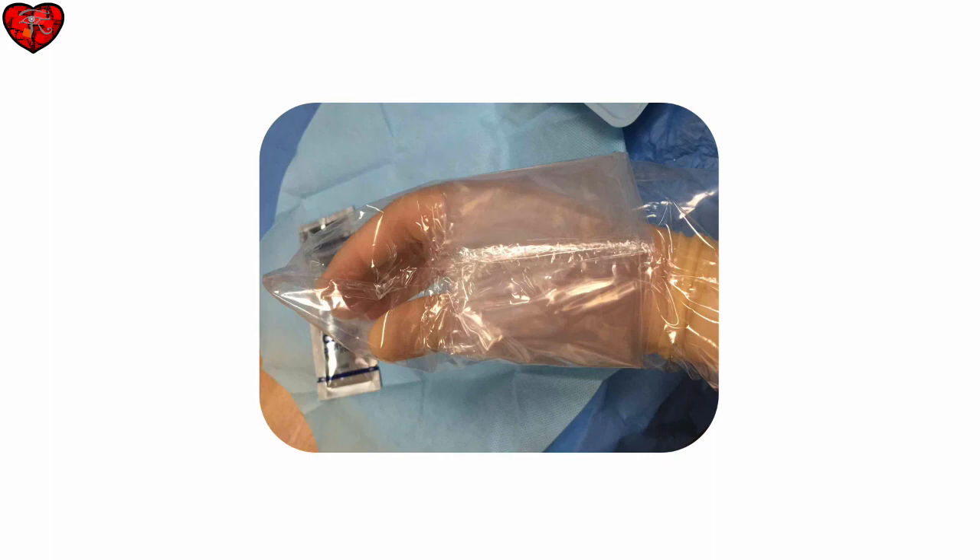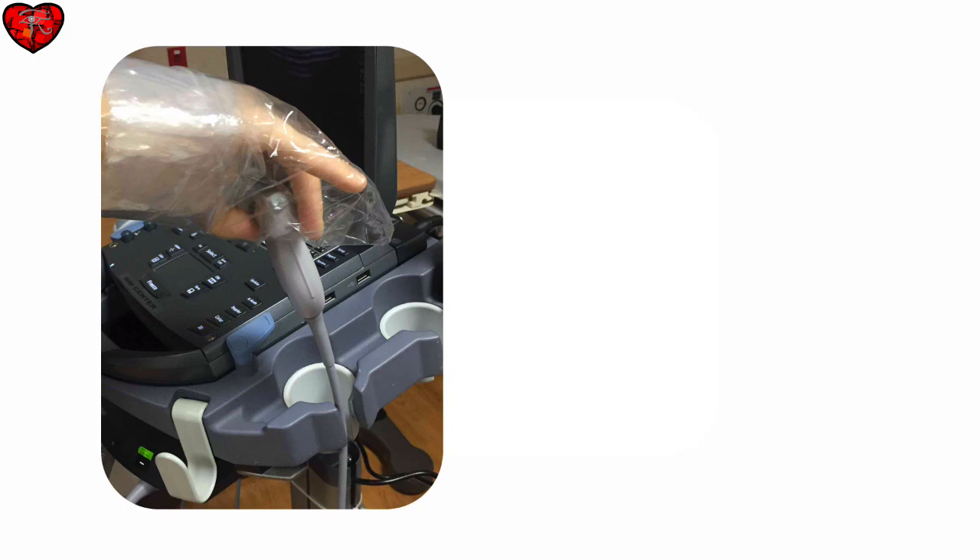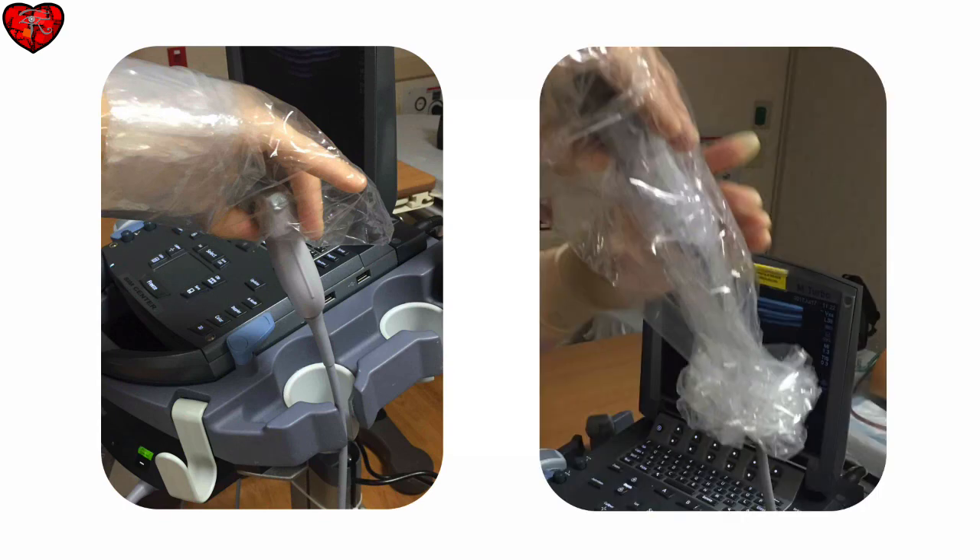First, put your hand through the sheath as if it was a sock puppet. Grab the probe while wearing the sheath on your arm, and then you can pull it through with your other sterile hand. Great!